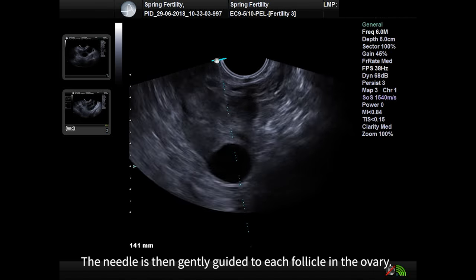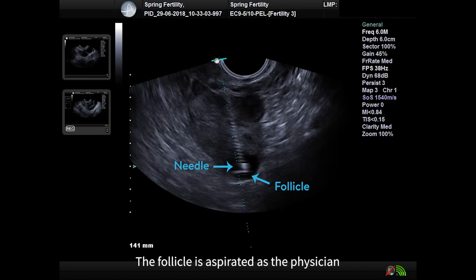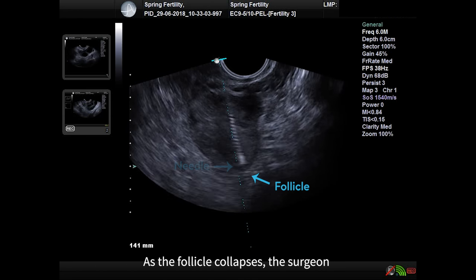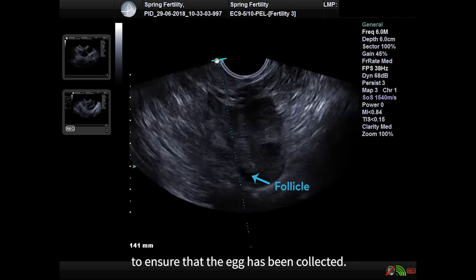The needle is then gently guided to each follicle in the ovary. The follicle is aspirated as the physician takes care to keep the needle in the center of the follicle. As the follicle collapses, the surgeon may gently curette the wall of the follicle to ensure that the egg has been collected.